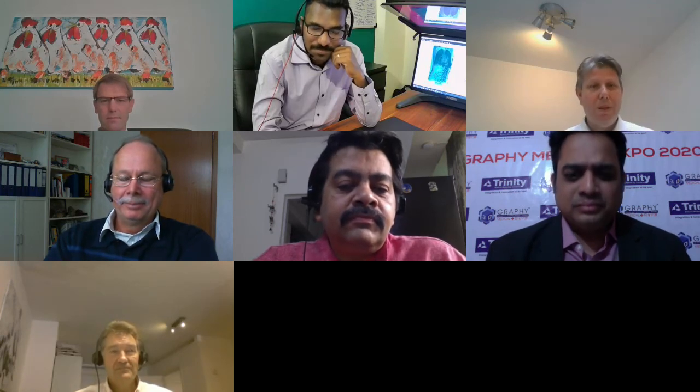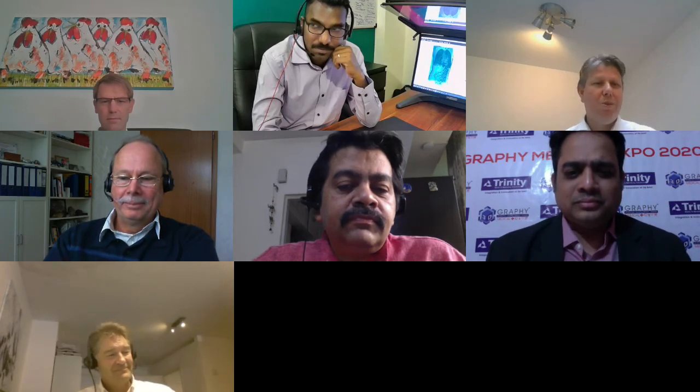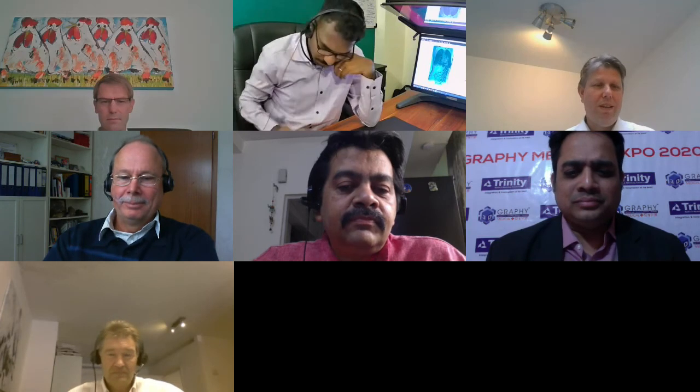And the beauty is with Visualisation 3D, what we have seen so far is that some of the users say, oh, it's great, it's wonderful, it's fantastic. And then we see what they do, and they use 1% of the possibilities. And then if I show that to my technicians, they're disappointed. But basically, we should be very pleased because that user has found his solution and can use it consistently and works fast with it. Other users have different requirements.